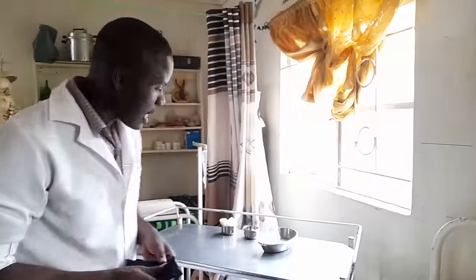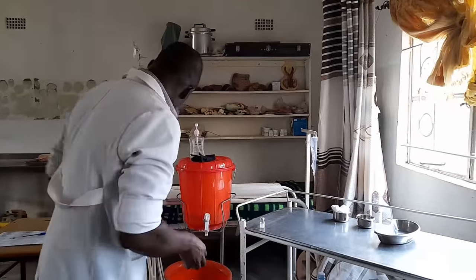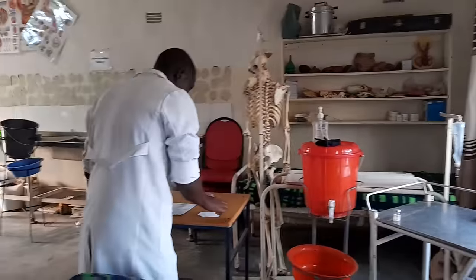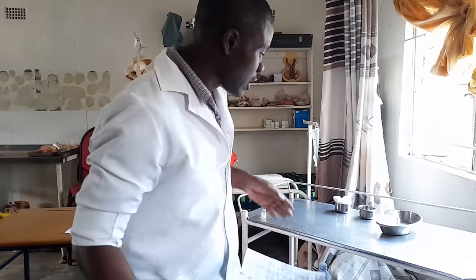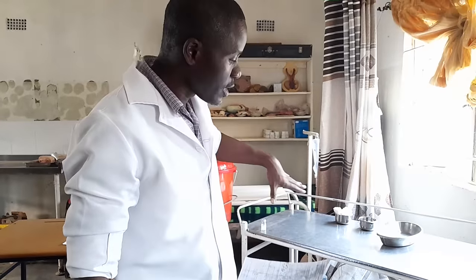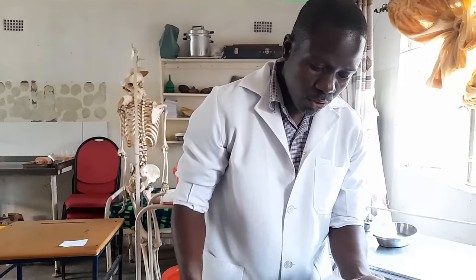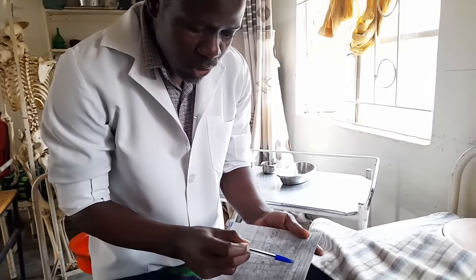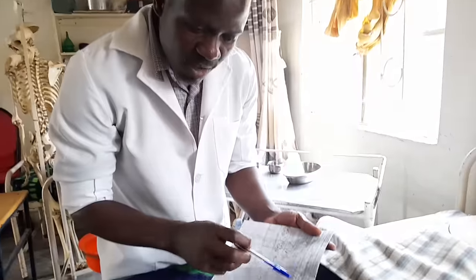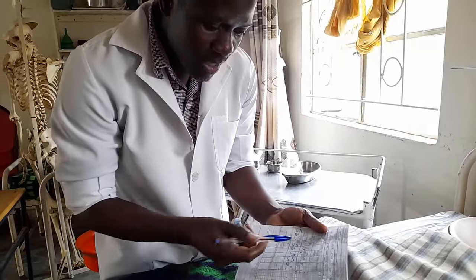Since the patient has allowed me, I can now go to the preparations. I need to go to the drug chart and approach the examiner. The drug chart and the paper for calculation are there. You're not supposed to calculate from the sterile field or near the procedure area. So you tell the examiner: 'My examiner, this is Mr. Luwoya D2. He's admitted in the male general ward and he's due for penicillin.'